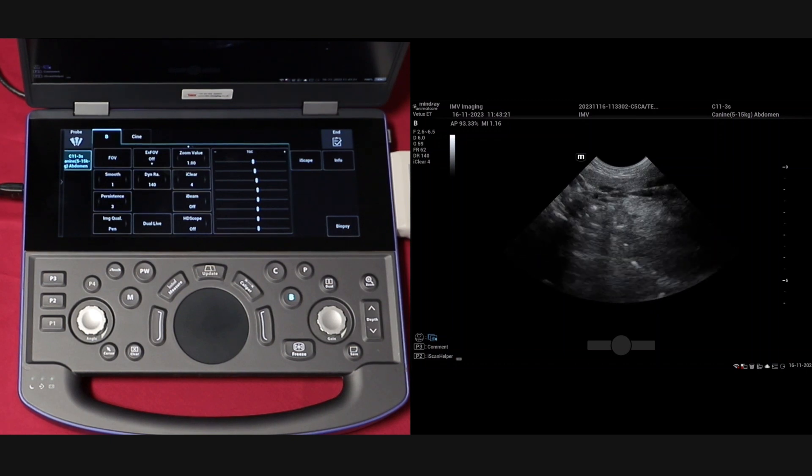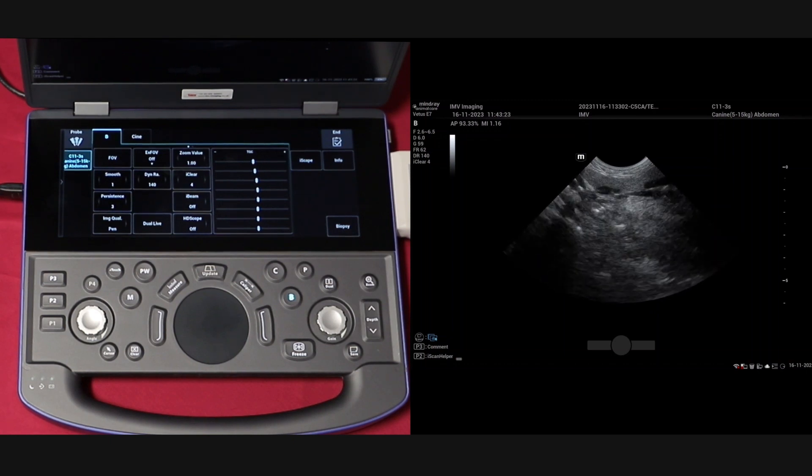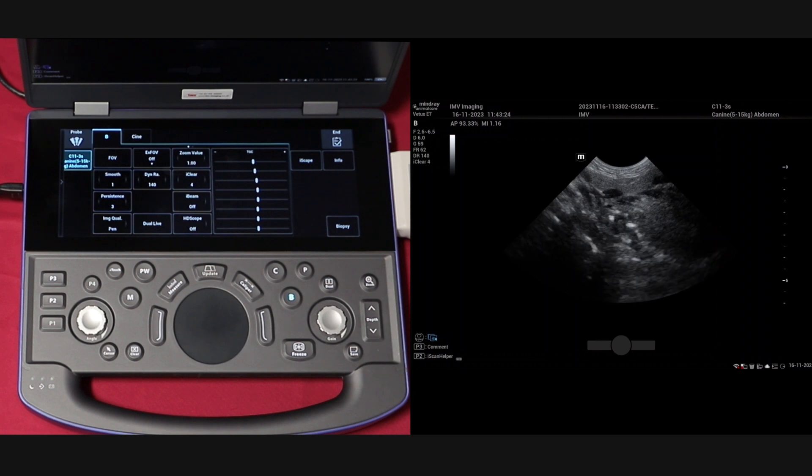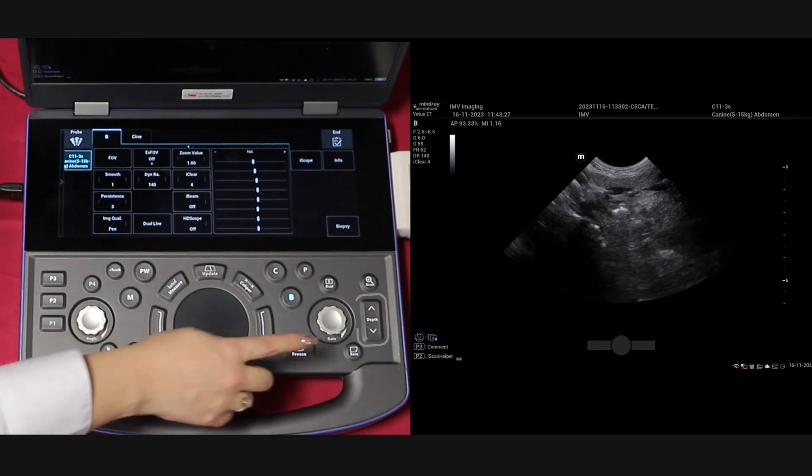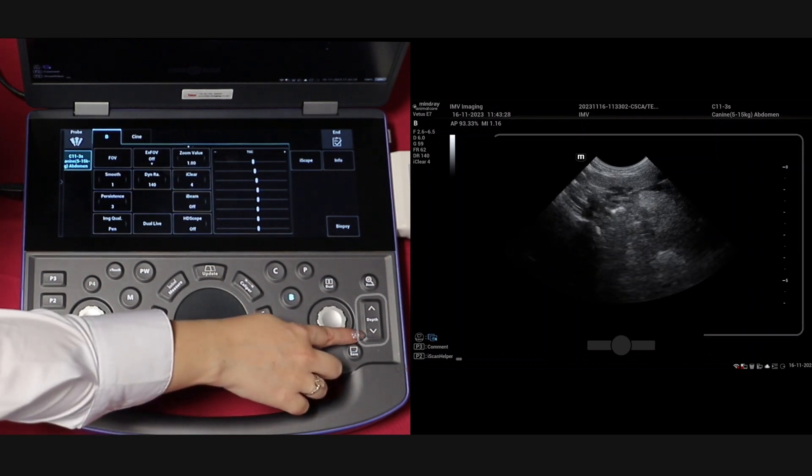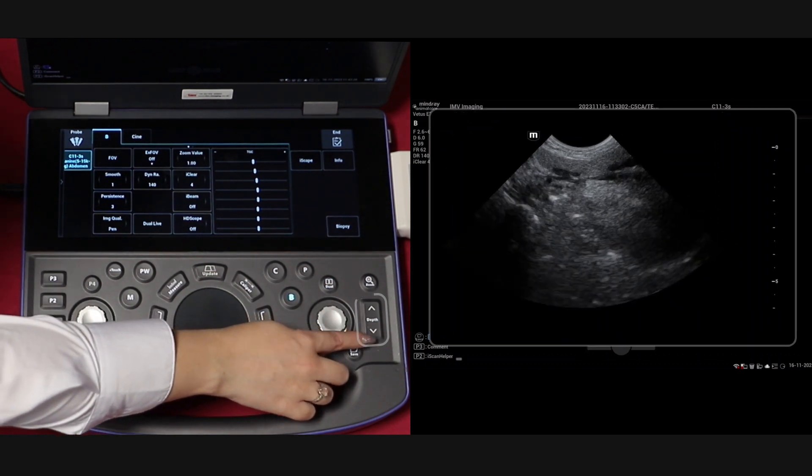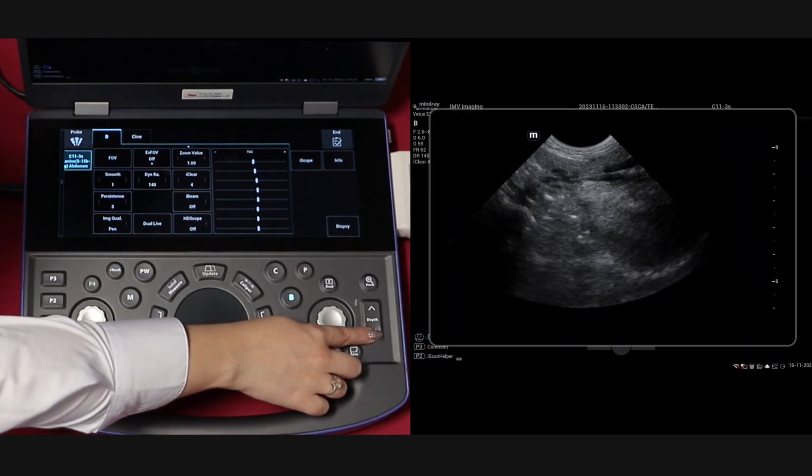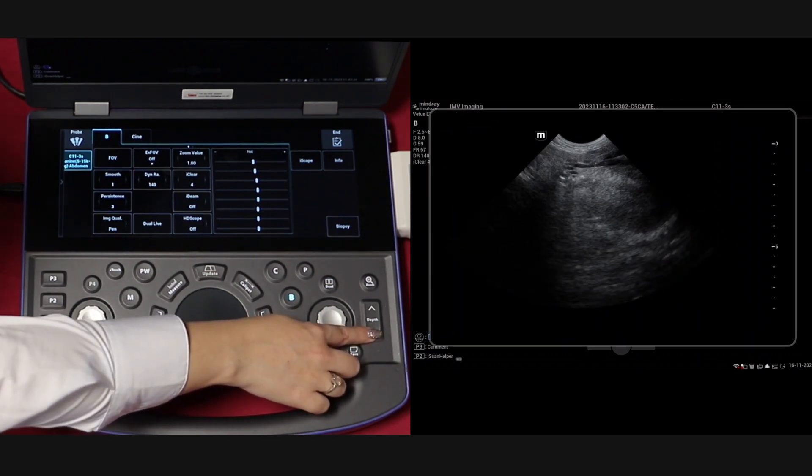We will now go through the main settings that you will need to adjust while performing your ultrasound exam. Starting with the depth, which is adjusted up and down using this button on the keypad.